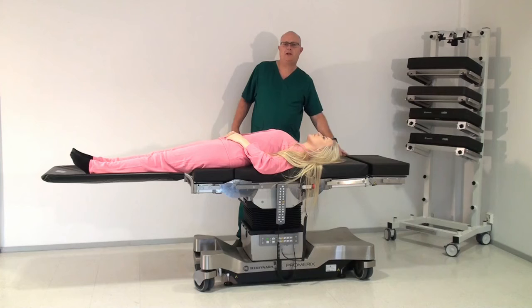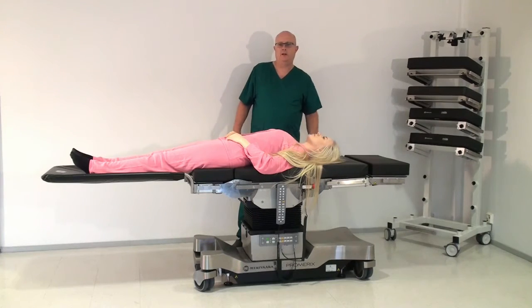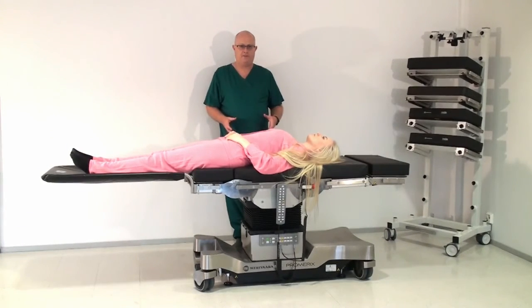So if you were doing day case surgery and you were using a laryngeal mask, you could put a 25-30 degree tilt on the back section of the table, but you still haven't got full control of the patient's head. So what we're going to do is put another 25 section instead of the 40 section for the back, and we can show then how we can shorten the table to make it easy for the anaesthetist.